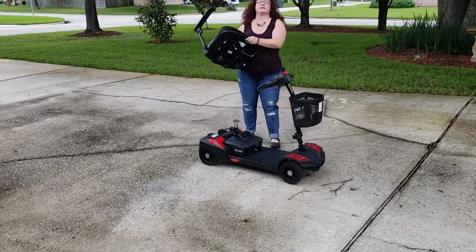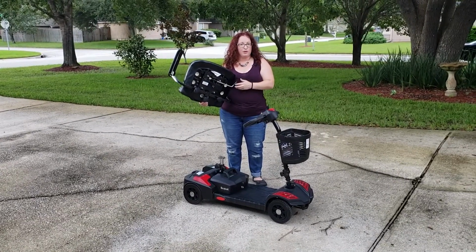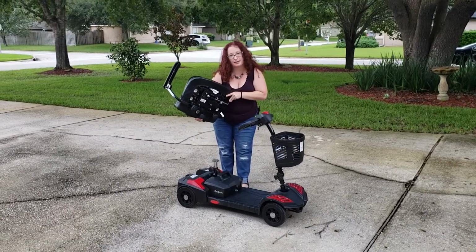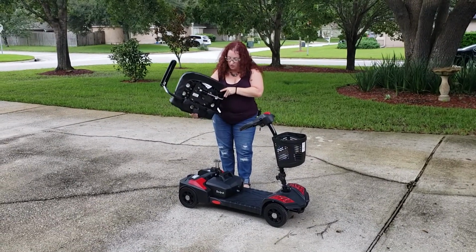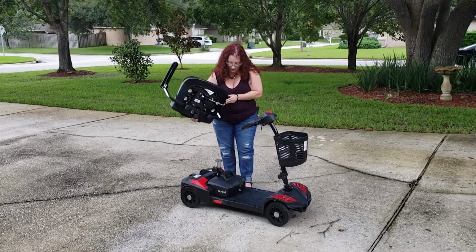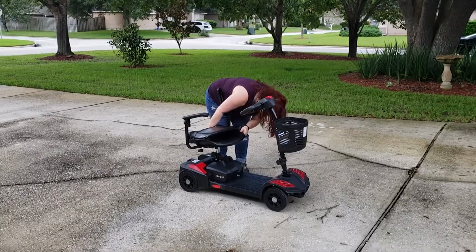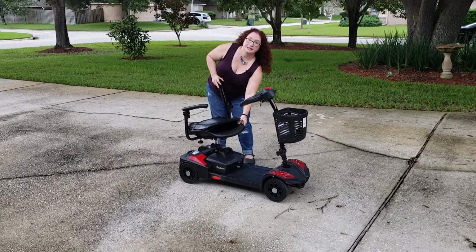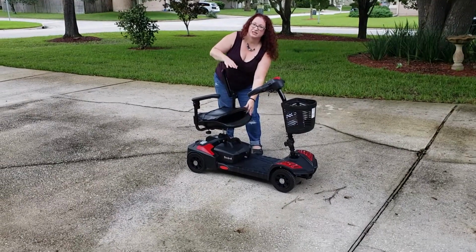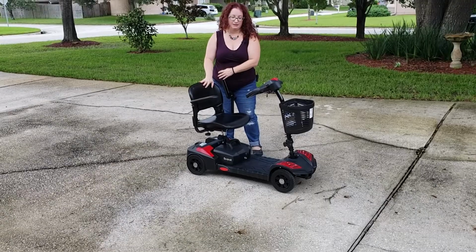This last part is the seat. So this lever is pretty important. You have to squeeze this lever upward in order to get it to sit properly on the post. So this black tube goes into the seat post. And if you squeeze the seat lever up, it'll go right into place. You might have to wiggle the seat just a little bit so that you make sure it's locked. And then the seat lifts up.